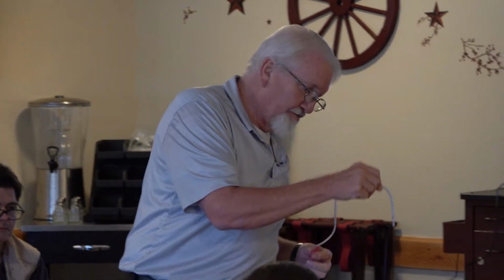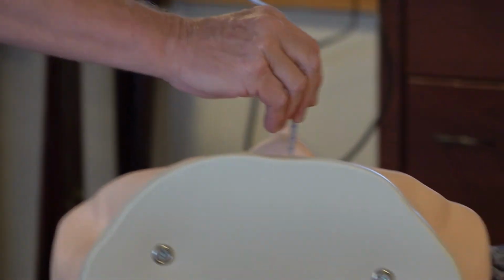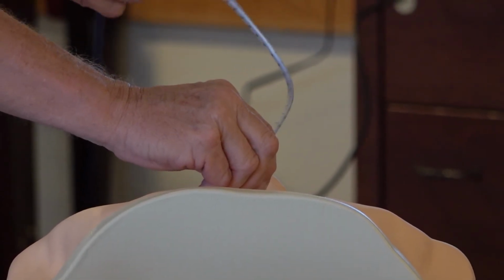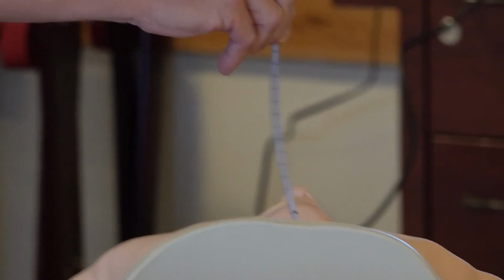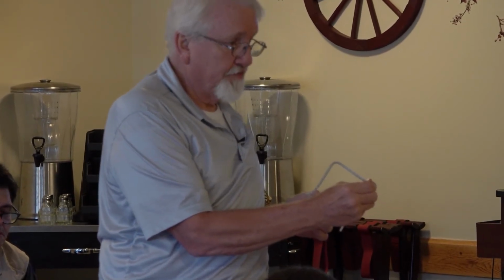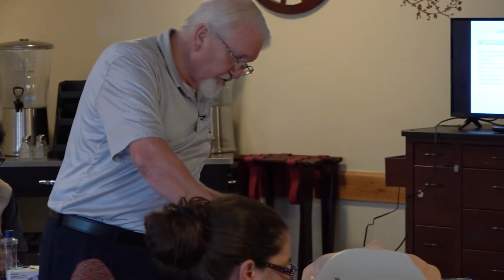When I insert the catheter into the trach, I am not suctioning. You're not suctioning when you insert in. So I'm going to insert, no suction, until I meet resistance. When I meet resistance, I'm going to back it out about a quarter of an inch, and then I'm going to start suctioning. I've seen folks do this, and they're just all over the place. That's fine. From the point you start suctioning to the point you exit the airway should never exceed 15 seconds, because literally you are sucking their breath away right now.